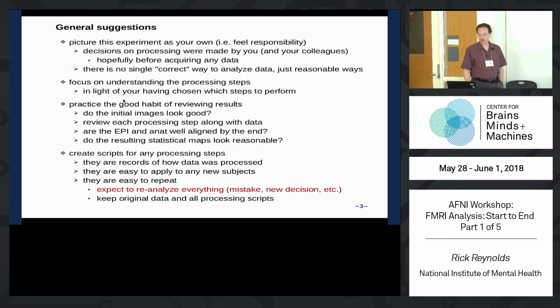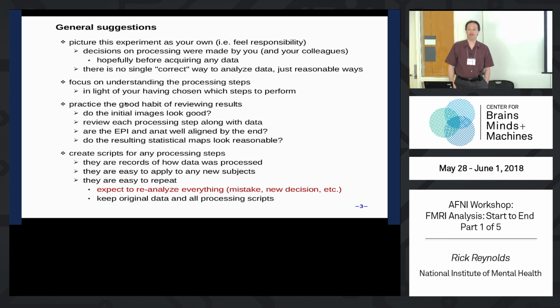Practice the good habit of reviewing the results. That's one of the biggest things, that's sort of a change in your mental focus. Actually looking at the data and seeing if it seems reasonable. No software is going to in general be able to figure out whether or not everything is good, whether there's a problem in this way or that way. The software isn't that great at it, and someone has to recognize problems and say, let's try to detect this problem.